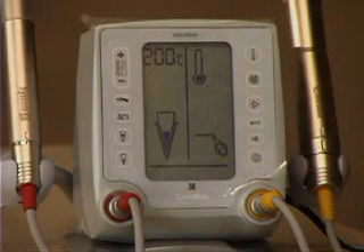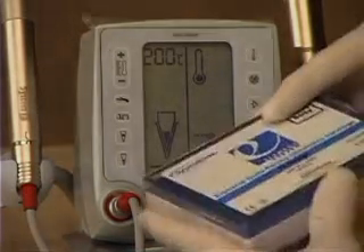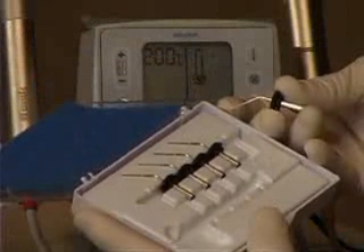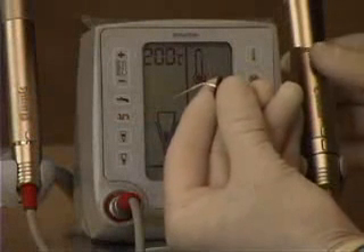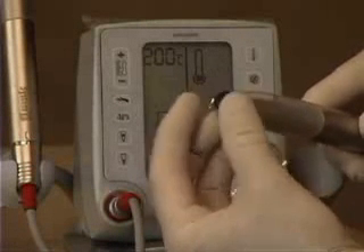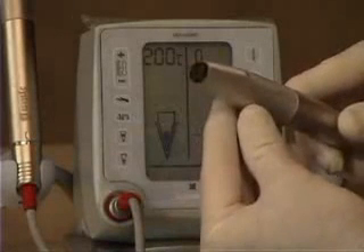This calibrates the handpiece and does not need to be done after the initial time. This icon shows the cartridge is empty or missing. We open the cartridge case and remove one of the cartridges — it has the needle, the gutta percha, and the attachment nut. The needle is already pre-bent, which is very convenient. It's placed in the end of the extruder and simply rotated to lock it in place.